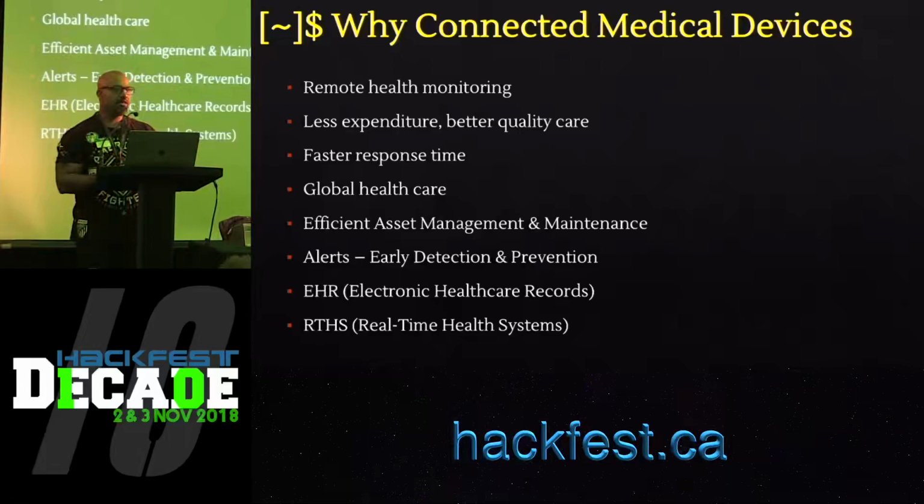the other system network. And then I suggested that perhaps we could, because in North America, in large hospitals, there are already around 12, 13 medical devices per bed. So I'm like, why can't we just do segregation per bed or per room? In that case, if the device is compromised, there's only going to be one poor bastard, but the rest of the other people would be safe.